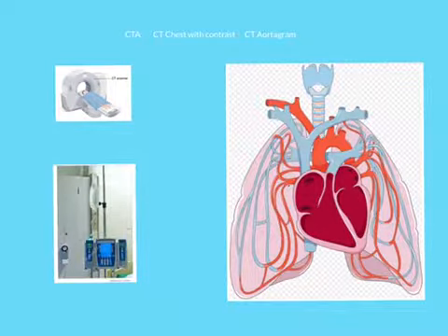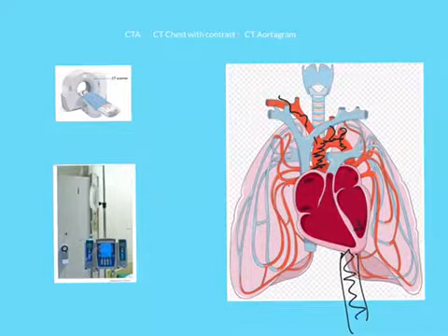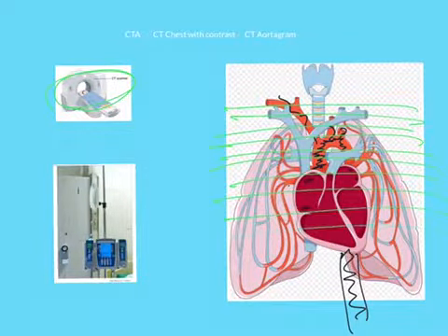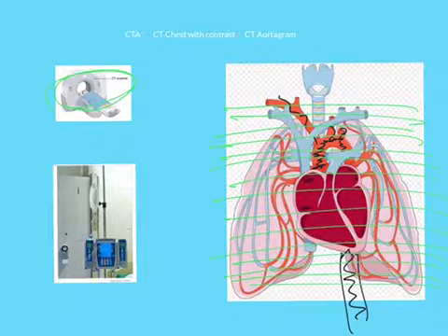So the bolus continues to move along. It's no longer in the pulmonary vasculature. The bolus has now moved along into the left atrium and the left ventricle, and it lives there for just a fraction of time. The bolus comes out of the left ventricle and now lives in the aorta. So here, and most importantly, comes down over here. So that's where your bolus is now. So now that your bolus is inside the aorta and you want to see what the aorta looks like, now's the time to fire up your CAT scanner, and then you start your scan when the bolus is inside the aorta.